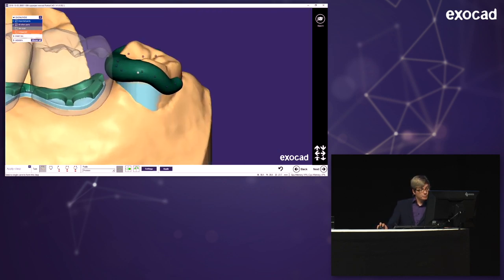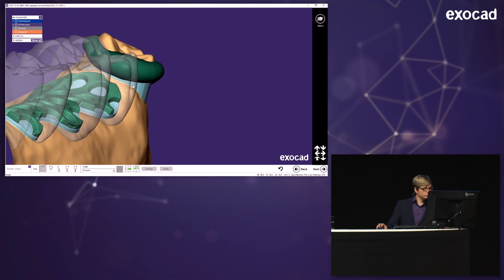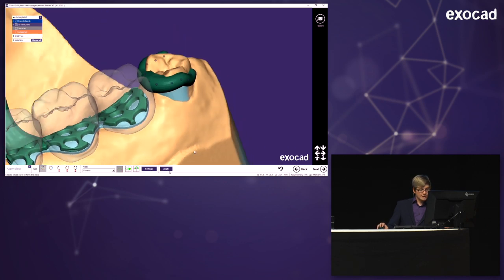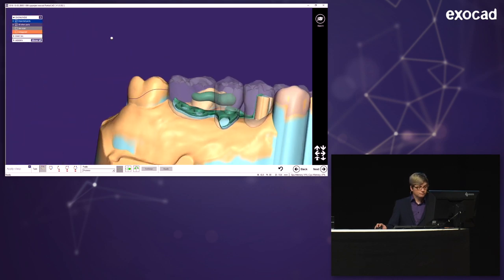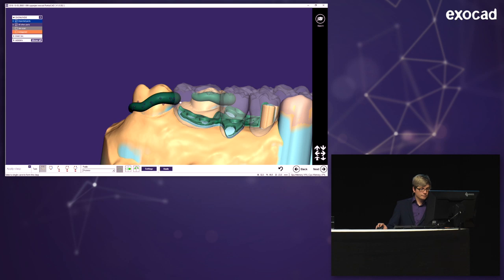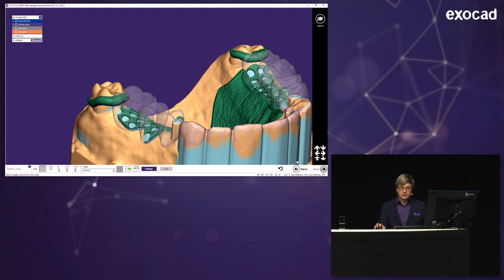And I can still pull those points around a bit and reshape the clasp. But this looks good, for me at least. Then I apply it. I do the same for the other clasp. Just click on it. Maybe change the shape, as you may have seen. There's also ring or round wire parts. But normally, if I change the shape once, it stays the same if I do not change it again. So, those are the clasps. It's pretty basic, straightforward.